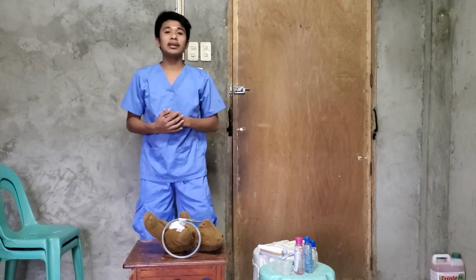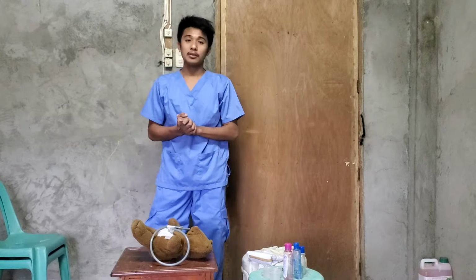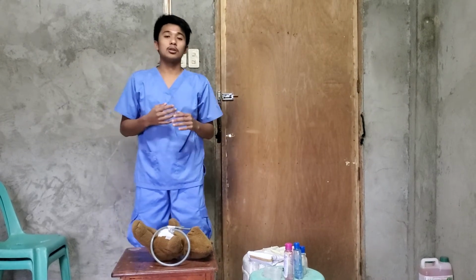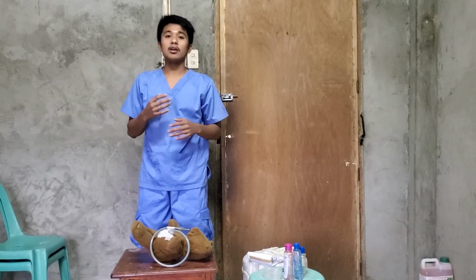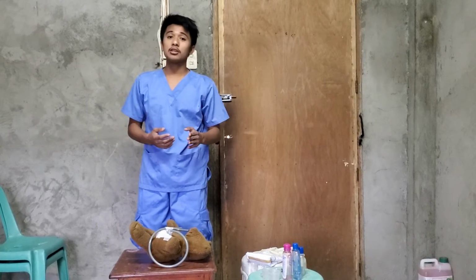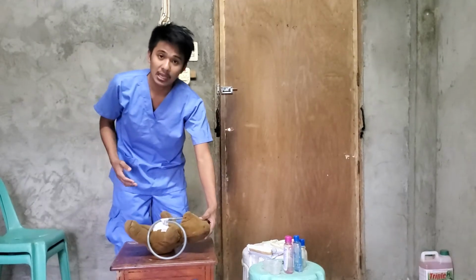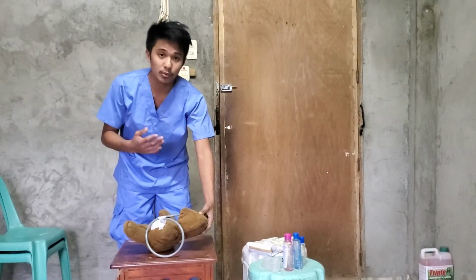After that is provide client privacy when performing the procedure by closing the door and by closing the curtain. Then the next step is explain the procedure, at his or her level of understanding. Then the next step is position the patient properly, with the head elevated at least 30 degrees or sitting position.